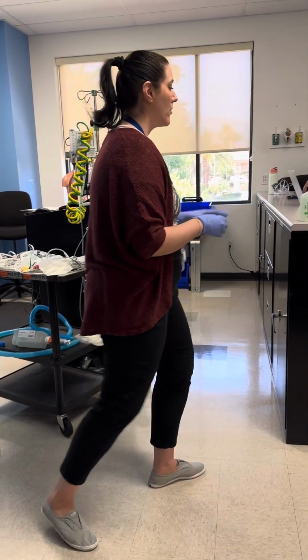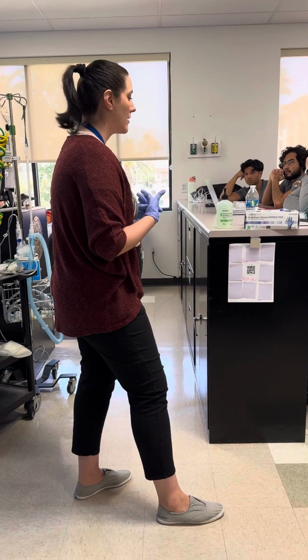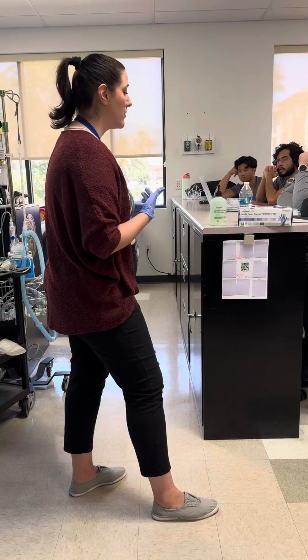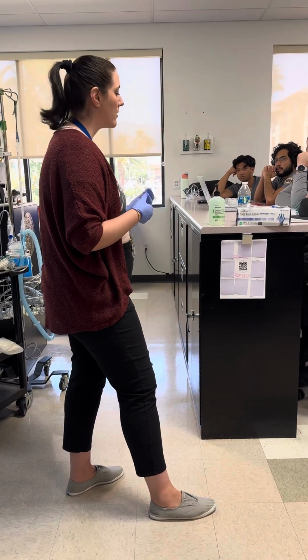Alternatively, your narrative could look something like this, where you've now identified whether or not you have an order. Then I'll come over to the table, put on my gloves and so on. I'll say, hi, Mr. Lennon, I'm Lily. I'm going to be a respiratory therapist. Looks like the doctor ordered something called oxygen therapy for you today. Is it okay if we go ahead and implement that with you today? Yes, of course, thank you.